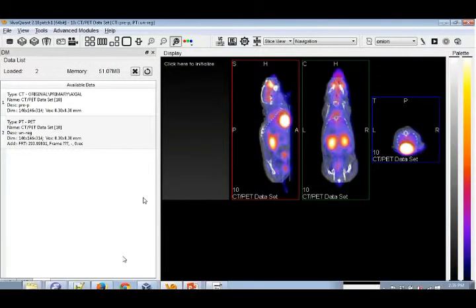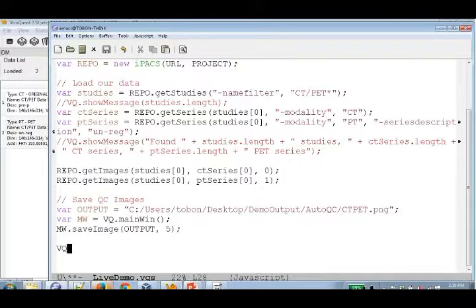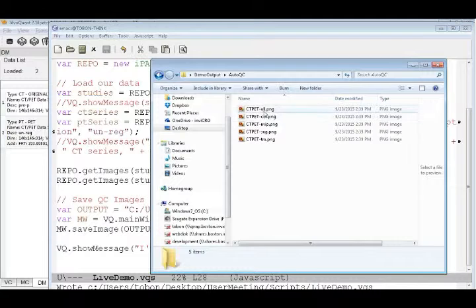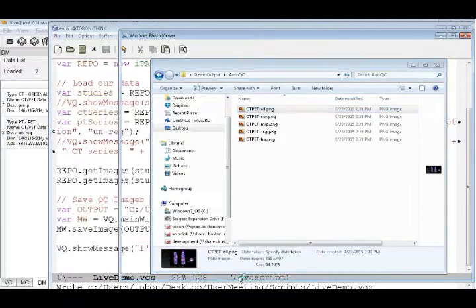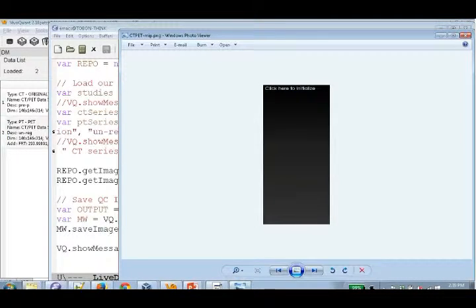Said it saved something. For future purposes, let's also give a nice little message at the end that says, I'm done. And let me check to see if that worked. Okay, I see stuff in here. It's looking pretty good, but you know, we have some problem. We have the VTK viewer didn't show up.